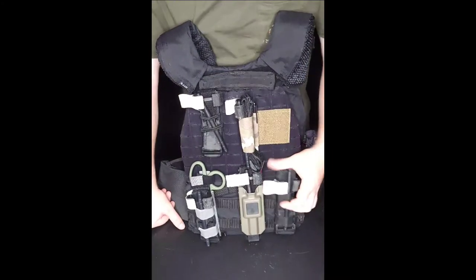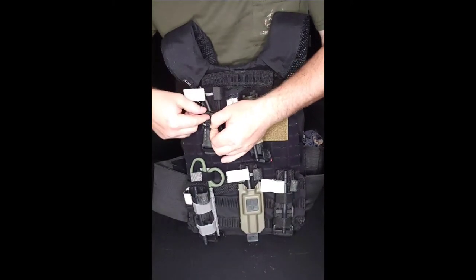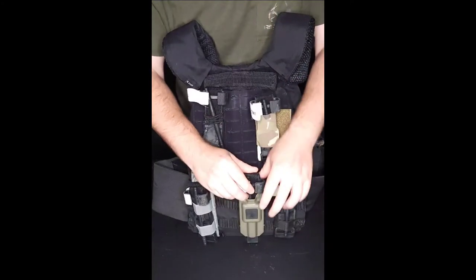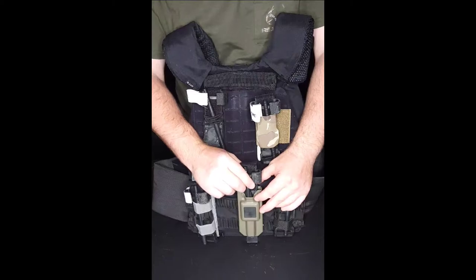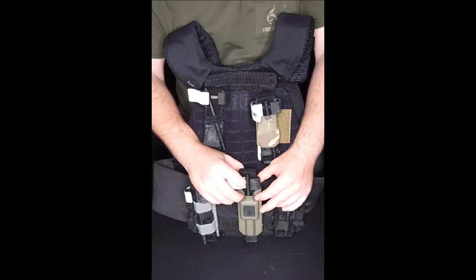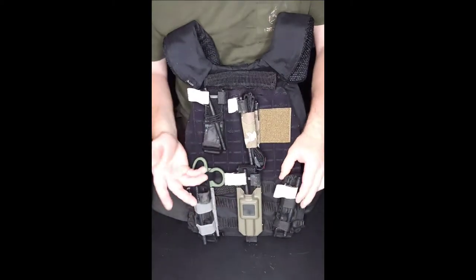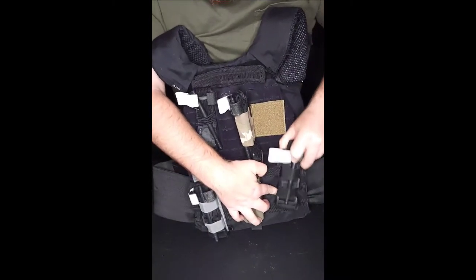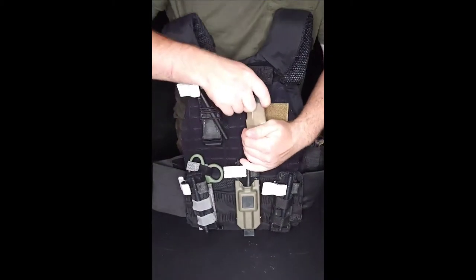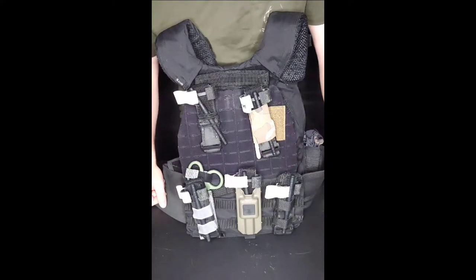Inserting the tourniquet is fairly easy for all the elastic ones. The kydex one is a bit tricky because you have to hold the plastic and try to feed it through. With the MOLLE elastic holder, as long as you fold it upright it'll go in no issues, but if it's too loose the tourniquet will just slide right out — there's no retention. Most of the other holders have pretty good retention and aren't coming out easily.